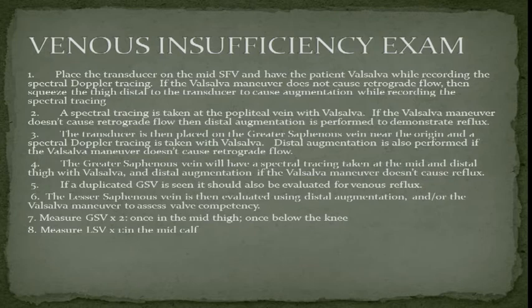The technologist has to keep labeling with this Valsalva or distal augmentation. The great saphenous vein will have a spectral tracing taken at the mid and distal thigh with Valsalva and distal augmentation, if the Valsalva maneuver does not cause reflux.